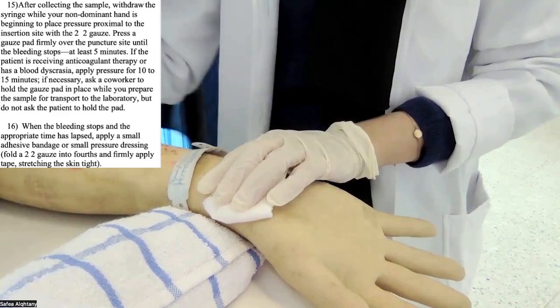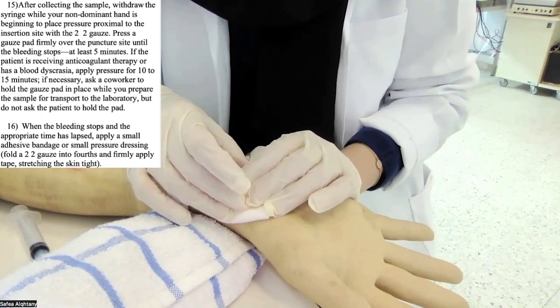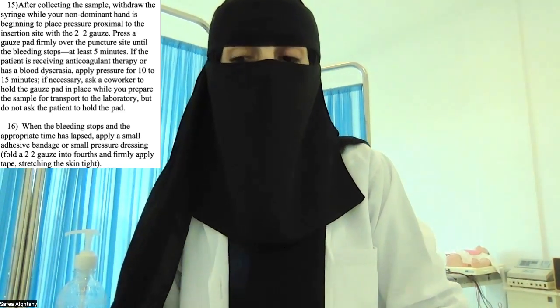Okay, and then I need to close the syringe with the syringe cup. I need to apply pressure for 5 minutes. If the patient, for example, has any problem like bleeding problem or bleeding disorder, I need to maintain or keep the pressure for 10 to 15 minutes to prevent further bleeding. في بعض الأحيان at the same time أقدر أطلب من أحد من زملائي أو co-workers أو nurse assistant to hold the pads and apply the pressure while I go to send the sample, but do not ever ask the patient to apply the pressure for themselves.